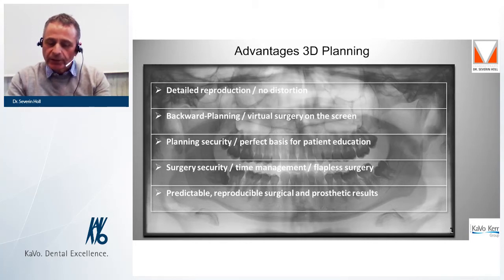We get predictability with regard to material and costs, as well as a perfect basis for patient education on the computer screen. For ourselves, we get a better estimation for the operating time, and it also gives us the opportunity to operate flapless, which is especially interesting for our elderly patients. Ultimately, we obtain treatments with predictable and reproducible results.